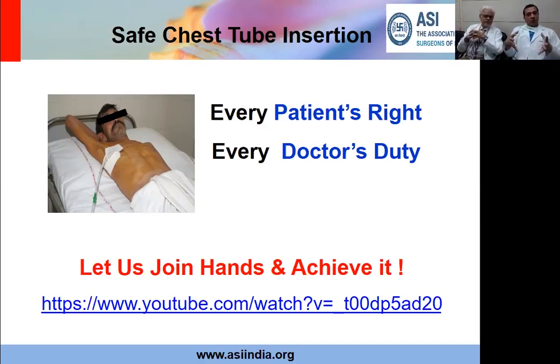But if it's a large pocket, if you think it's infected, if it's causing respiratory compromise or there is some other associated issue, then I would go for an ultrasound guided, another separate pigtail or chest tube being put into this loculated effusion.